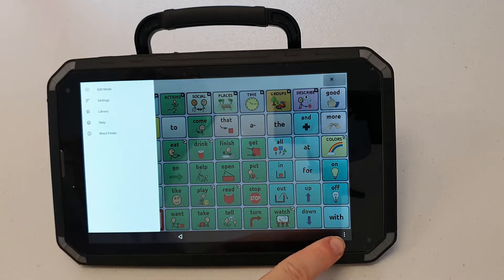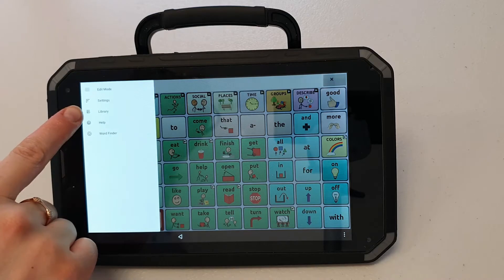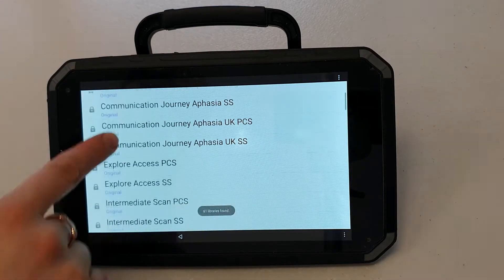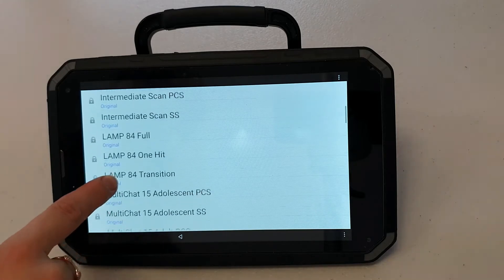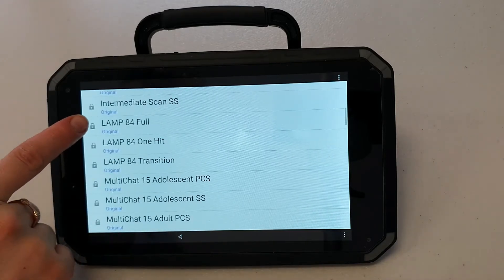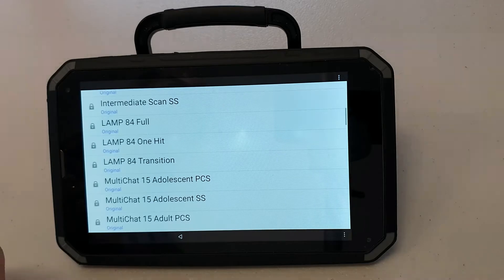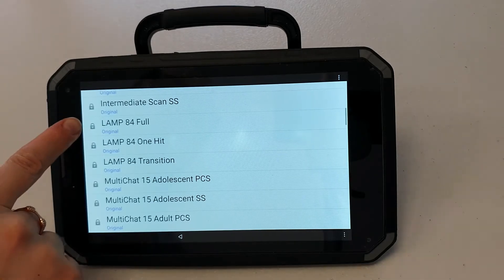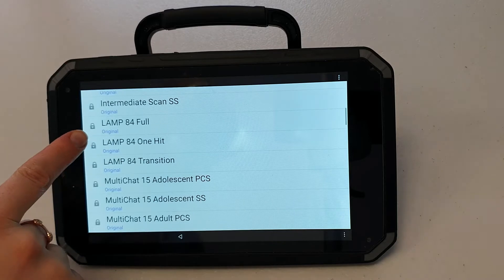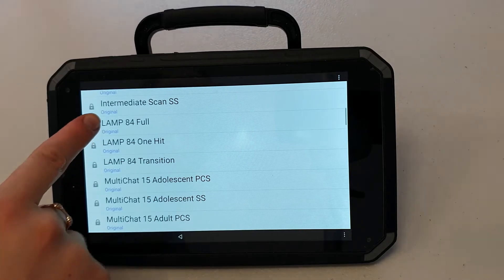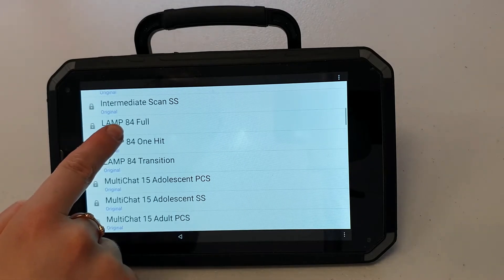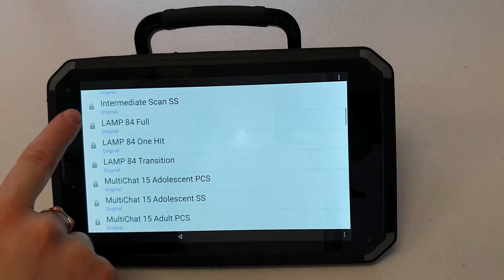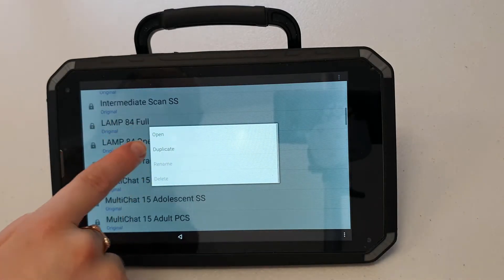I pressed my menu button and then I've gone to the library so I can change over to LAMP. I'm going to see here that my three variations of LAMP Words for Life are in the library. Each of them will have a padlock next to them which is telling me it's the original file. I want to make a copy of the original of LAMP 84 full so I'll press it. I'll press duplicate.